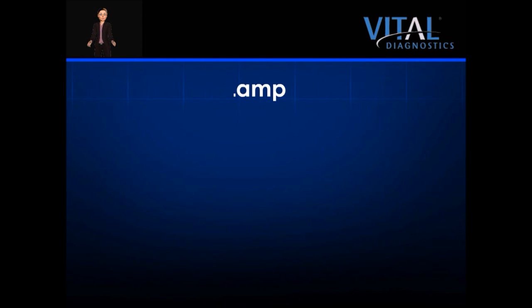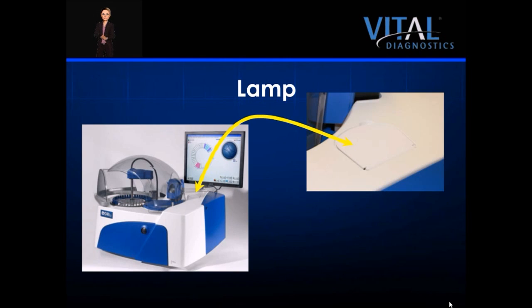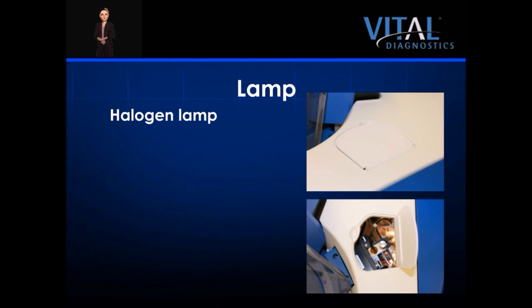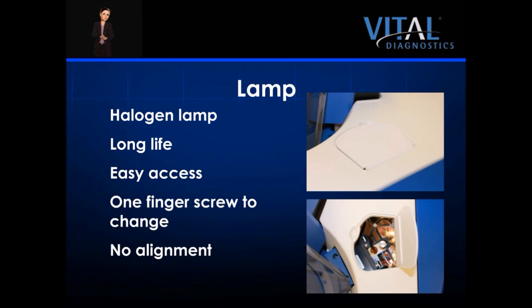The EON100 utilizes a halogen lamp for its light emission. The lamp is located under the small panel door on the top right side of the analyzer, just below the monitor mounting arm. The long-life halogen lamp is accessed through the small panel door. To change a lamp, merely remove one screw by hand and lift the unit. There is no alignment needed upon placing a new lamp in the instrument.